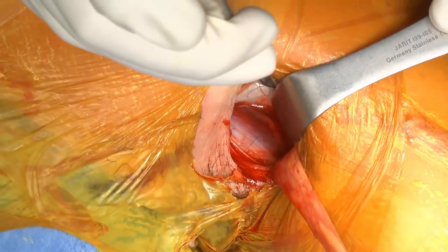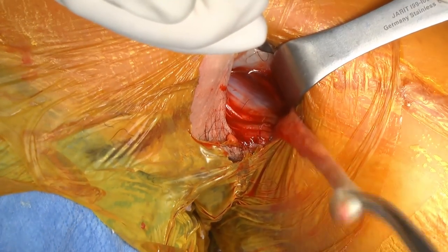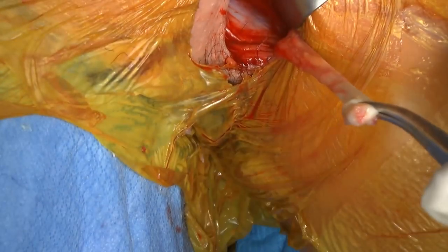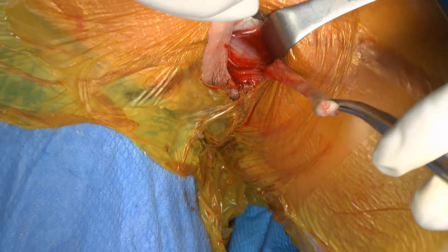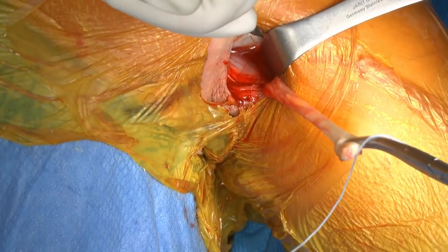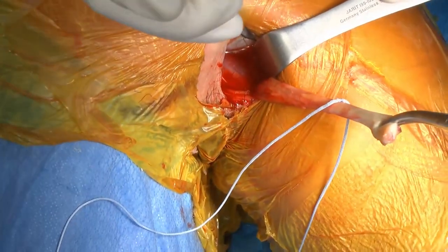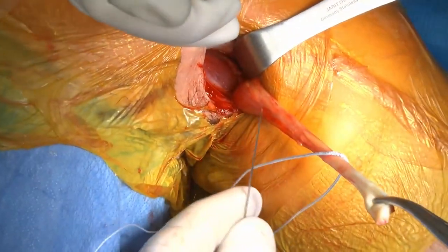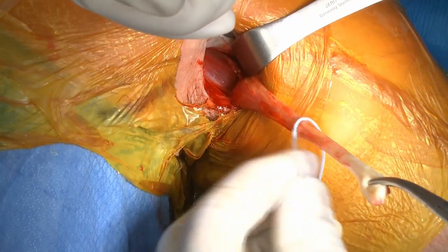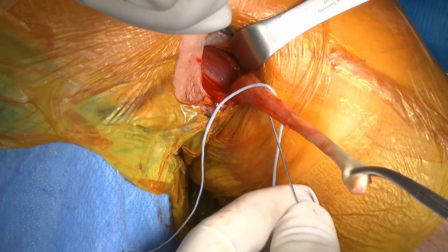So we're now going to take a fiber loop, and we're going to go to the top of it. So hold this here for me, Chris. We're just going to have to do a little dance. Thank you. So slide that over. And at this point, I pick how far I want to go down the biceps. So we'll pull on the biceps. We see the muscle is right here. We're going to go just above that muscle tendon junction. And we'll slide through.